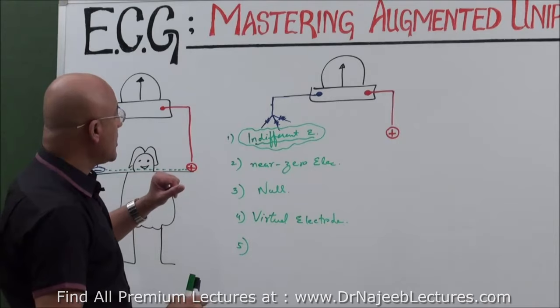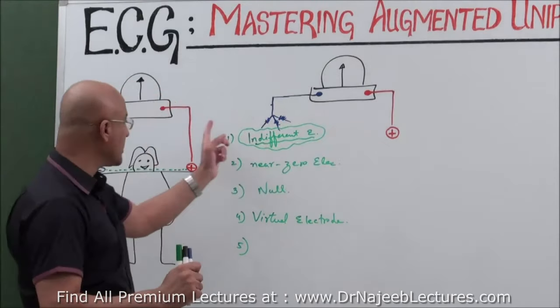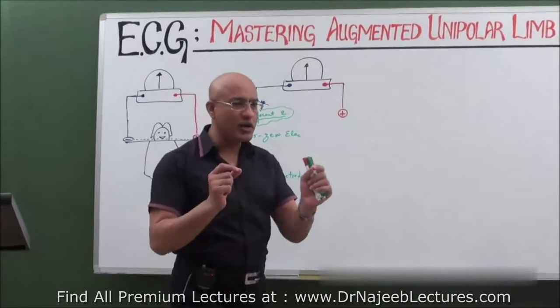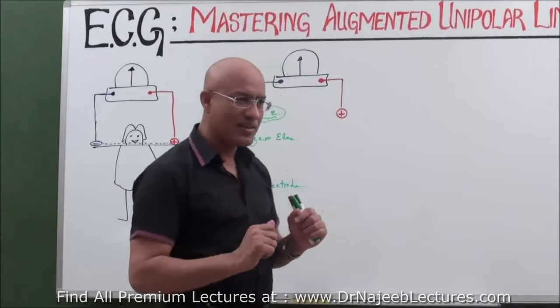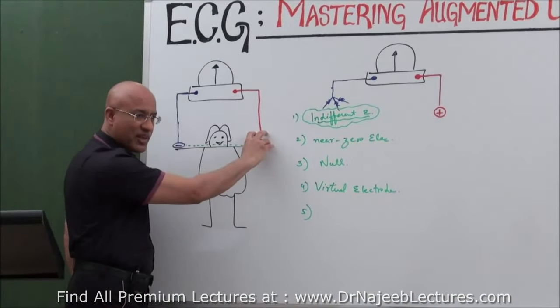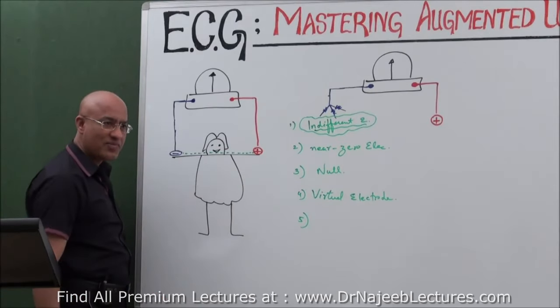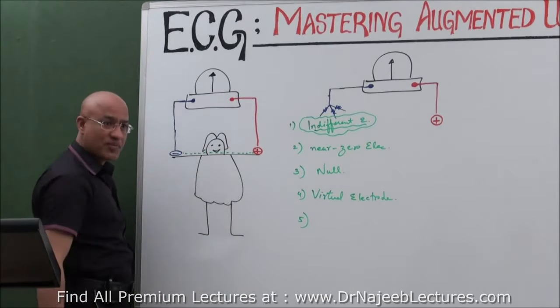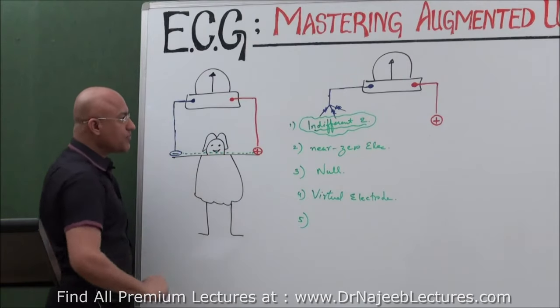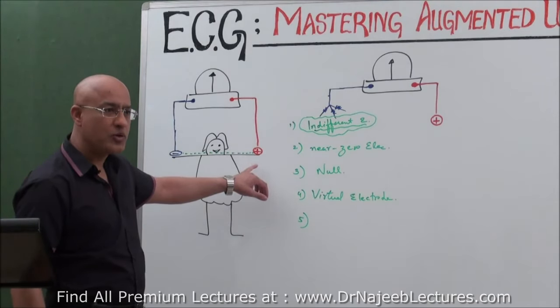Now, let me explain it further. Why is this called unipolar, and what is the difference? A bipolar lead is something like a very young hot couple. This is like a young boy, the positive electrode, and the girl is also reactive positively, the negative electrode. And there is a lot of heat in between. Voltages are very high. There are two poles. Now, after 20 years of marriage, a happily married couple with 5 children, do you think the woman remains so reactive?